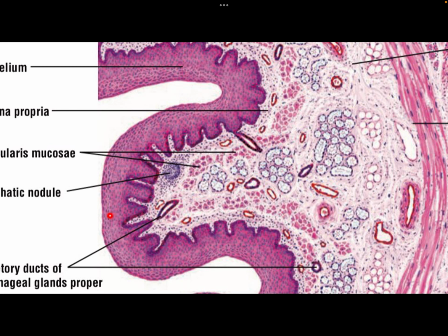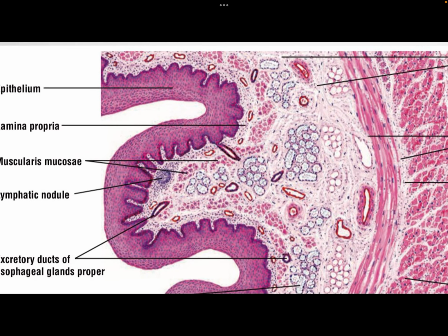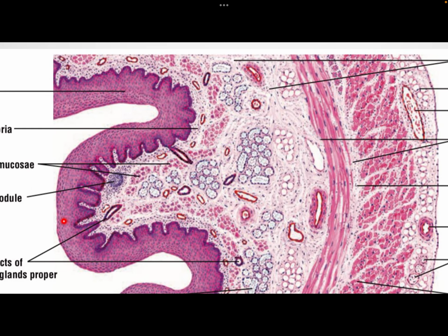All right, so this is basically a stratified squamous epithelium. How do we know it? I gave you a small hint about what the stratified squamous epithelium looks like, but for more details, I'm going to have another channel, another playlist to explain the basic histological information, which cannot be explained here in detail. All right, so here we have the epithelial lining.